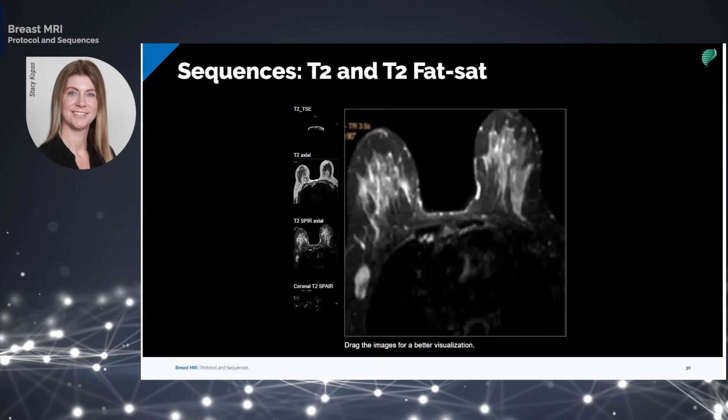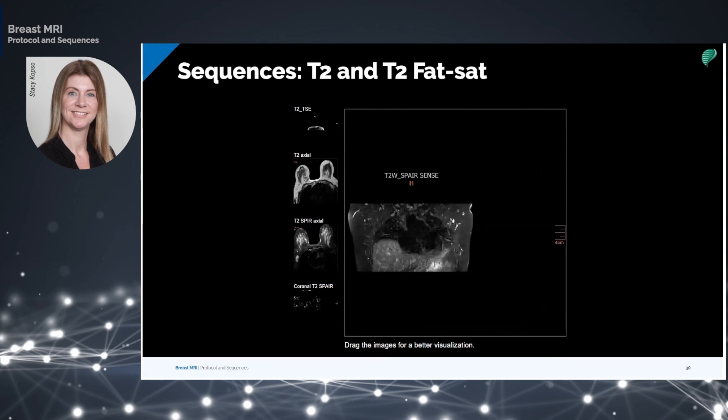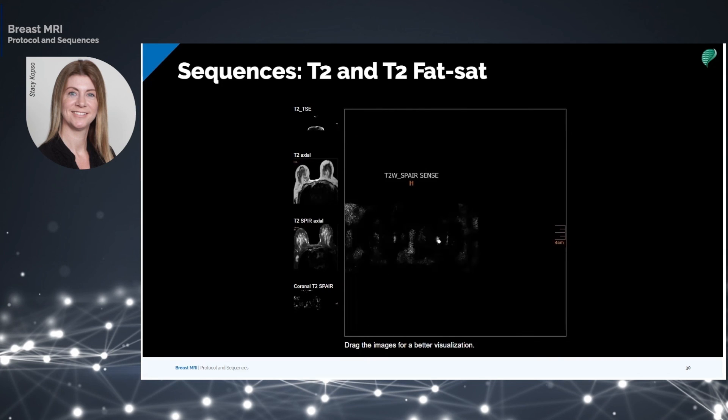T2 and T2 fat suppression are also done in coronal slices. Coronal imaging has its advantage in reduced heart pulsation artifacts and enables bilateral imaging of the breast. As mentioned in Module 1, coronal images best demonstrate the circular body of the breast and the axillary tail.